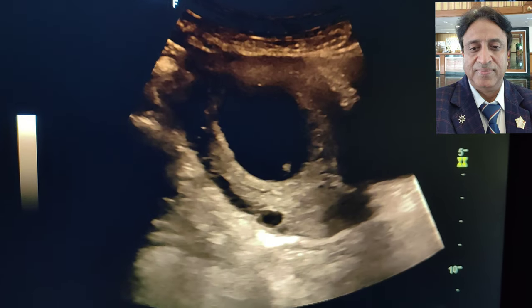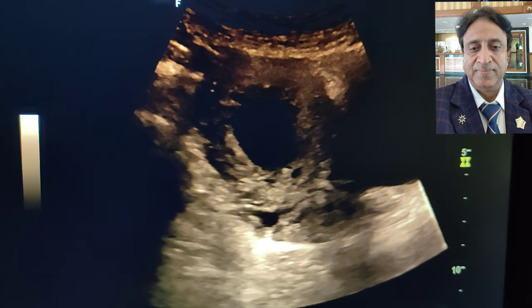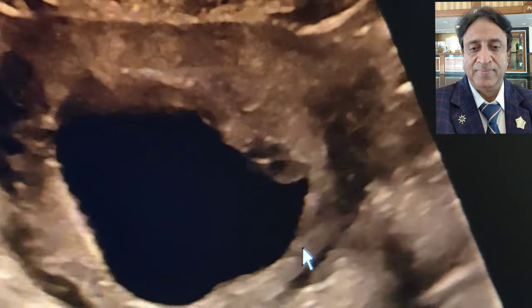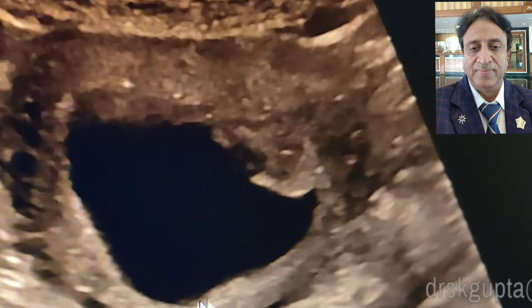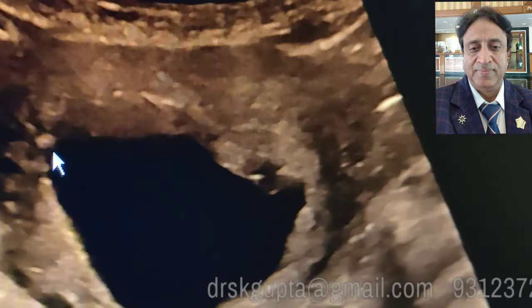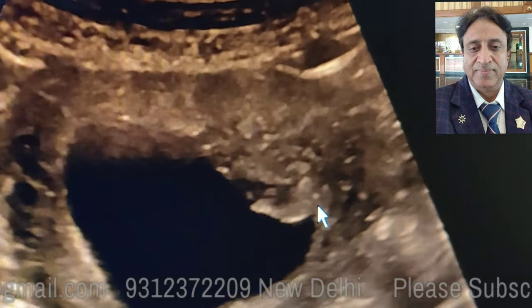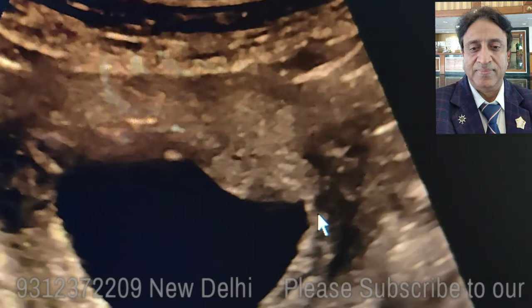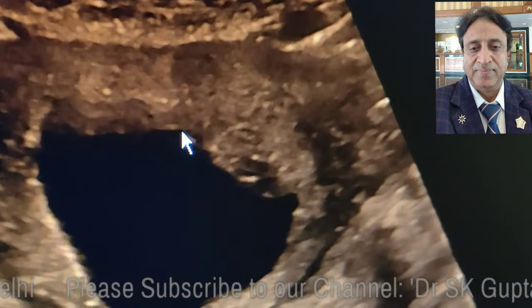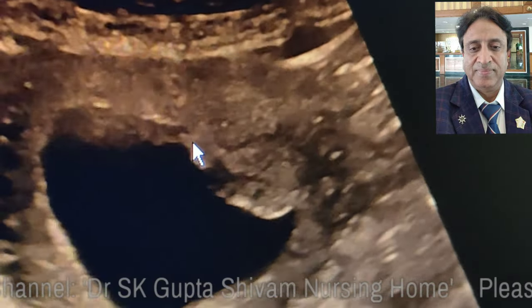She is a lady who has come to us with a last menstrual period about 12 weeks back. You can see that this gestational sac is irregular in shape — it is pointed in one plane — and this irregular sac is a feature of missed abortion.